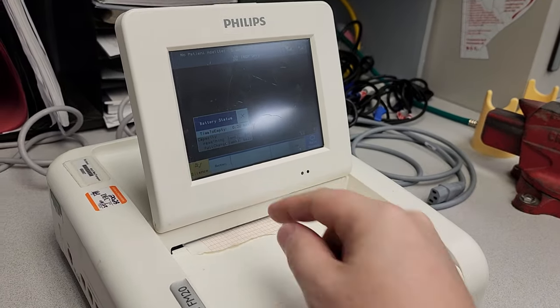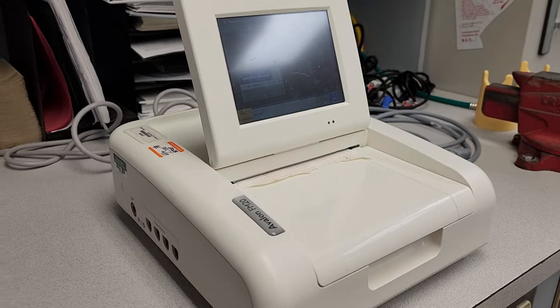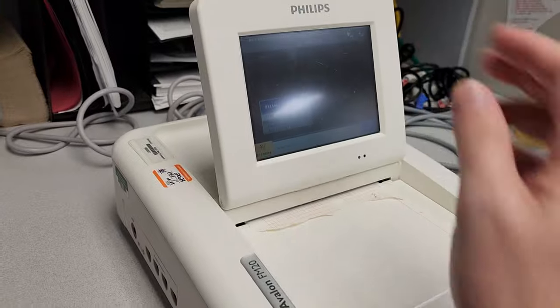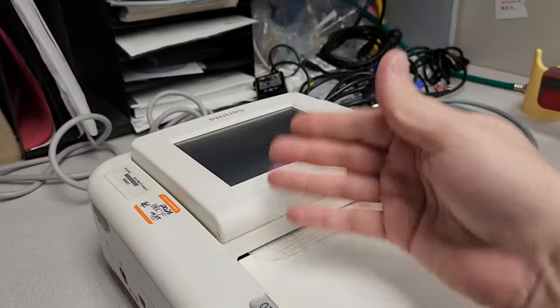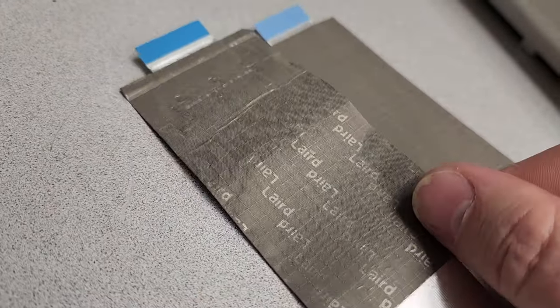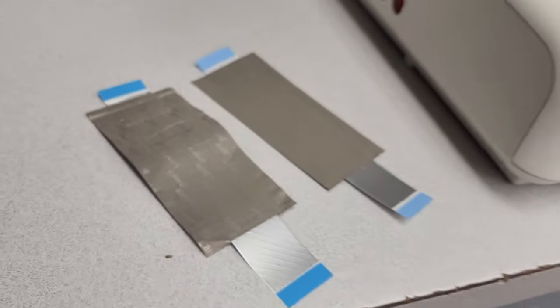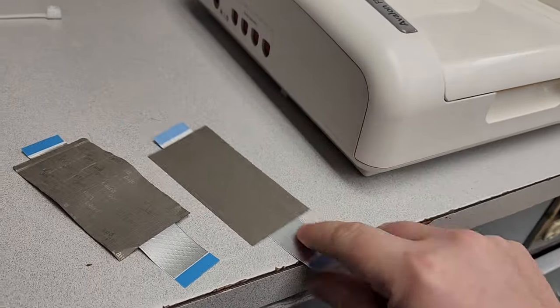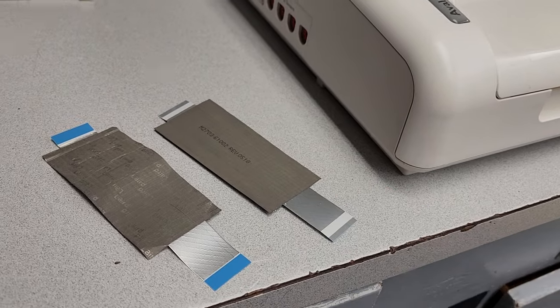What does break are the pieces that articulate, which is this. It articulates when the user lifts this guy up, puts it down. They probably do that hundreds of times. And this is what you get. You have a cable, which is basically a consumable. Always keep one on hand. If you guys have these Avalons, keep one of these ribbon cables. Just keep it. Trust me, you'll be better off.